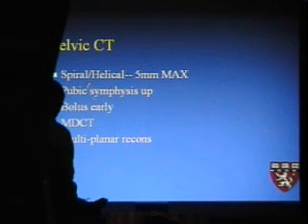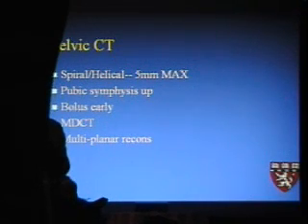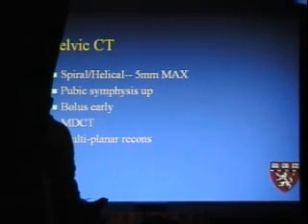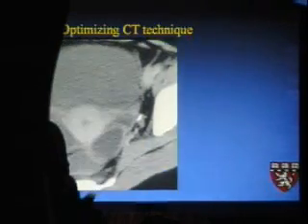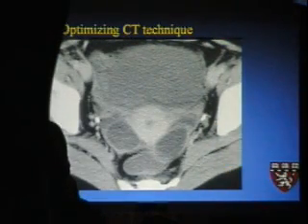We used to, in the old days when we couldn't get down fast enough with the bolus, have a dedicated protocol where we would scan from the symphysis upwards, and that can be helpful if you're interested in doing that approach. But now most of the time it's not necessary. One thing that's critically important in pelvic CT is really to use oral contrast material.